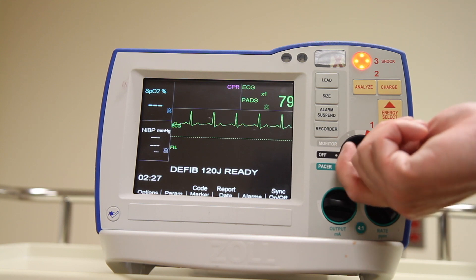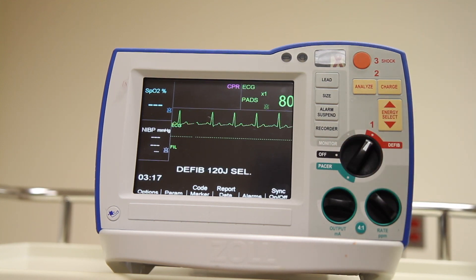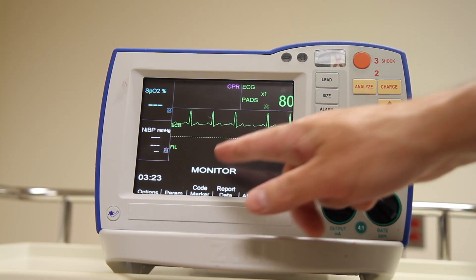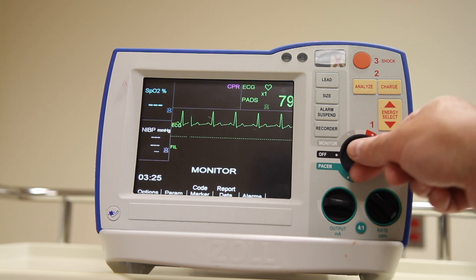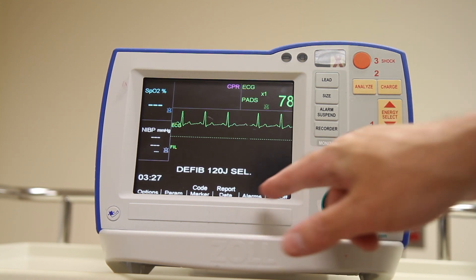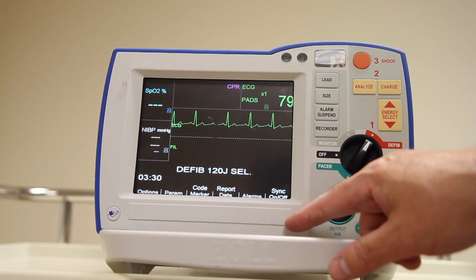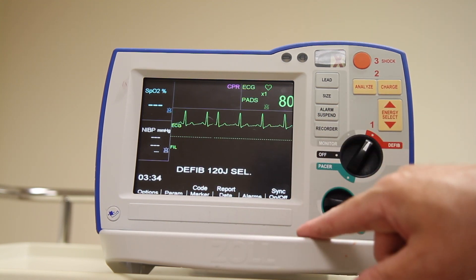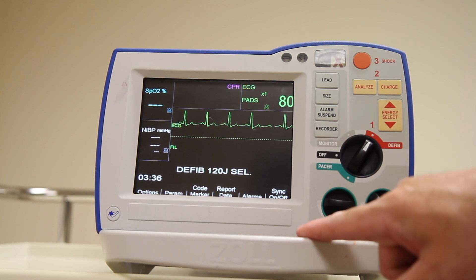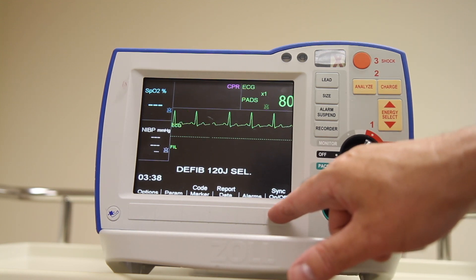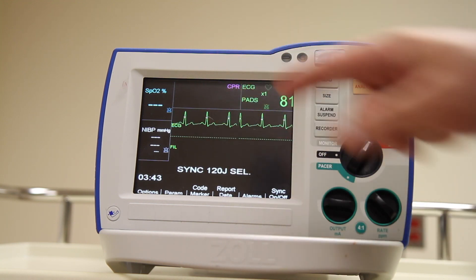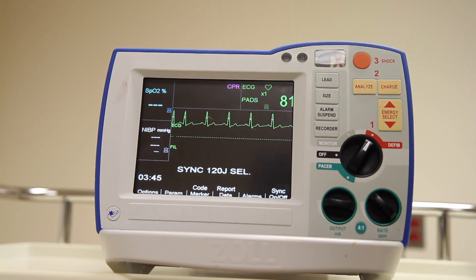Next up are the controls to perform synchronized cardioversion. When I switch the device from monitor mode to defibrillator mode, the soft buttons along the lower edge of the device become active. One of those soft buttons is to turn synchronization on or off. By pressing the soft button I will turn on the sync, and I should start to see markers associated with the QRS complex.